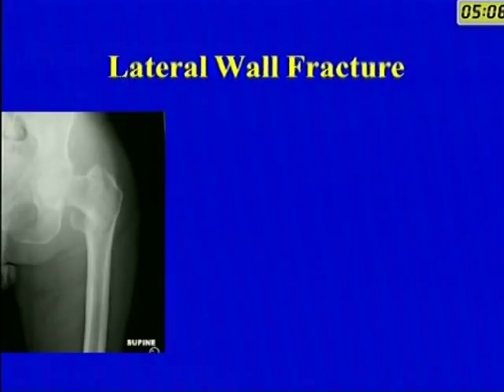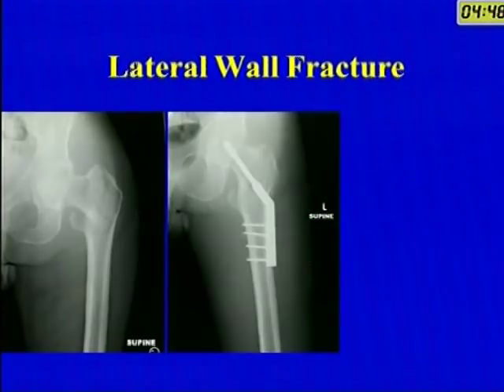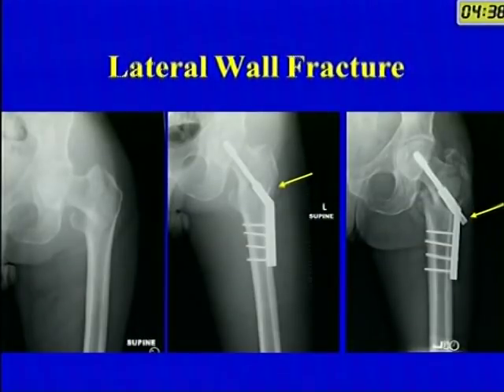The second concept which you have to remember is that of a lateral wall fracture. And many of us, I myself included, did not, until recently, recognize the importance of this. An innocuous looking fracture like this, fixed with a DHS, develops a fracture of the lateral wall, ultimately leading to excessive collapse, excessive medialization of the distal fragment, and in more severe cases it can lead to a failure of your fixation.